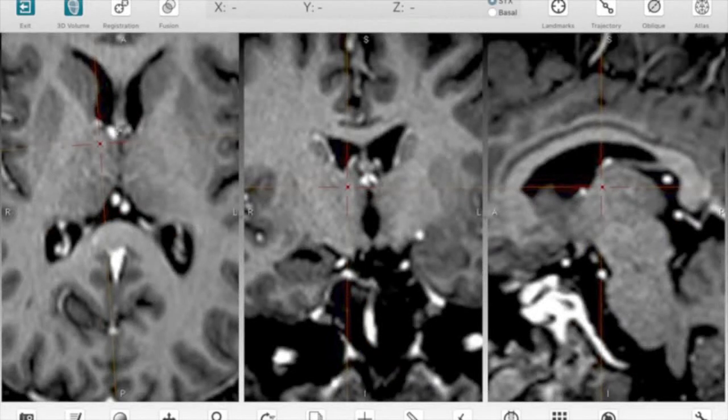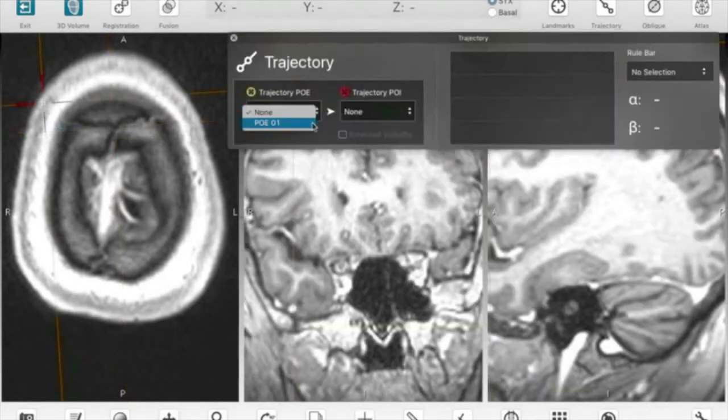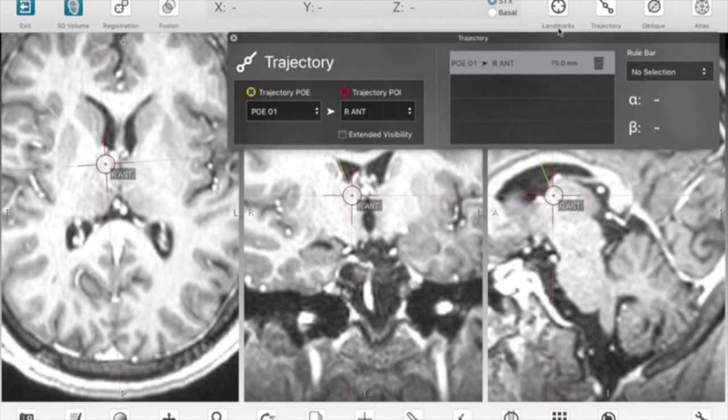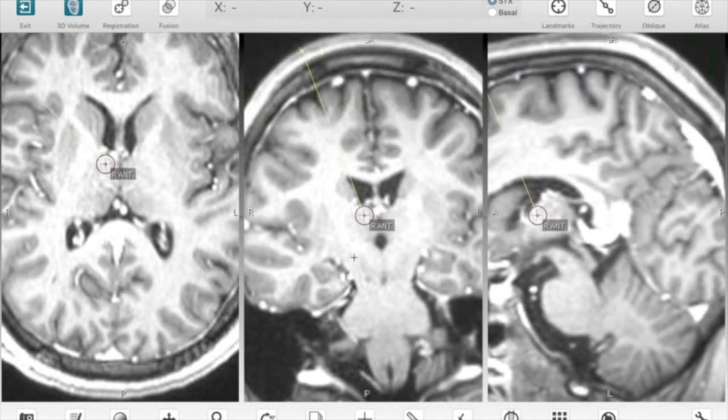It is of extreme importance to address the vessels near the target, as they may limit the trajectory when implanting the electrode. The burr hole for entering the cortex is generally placed 1.5 to 3 cm lateral from the midline and 1 cm in front of the coronal suture, but this may be adjusted according to the safest trajectory. We should avoid major vascular structures and superficial and deep sulci.